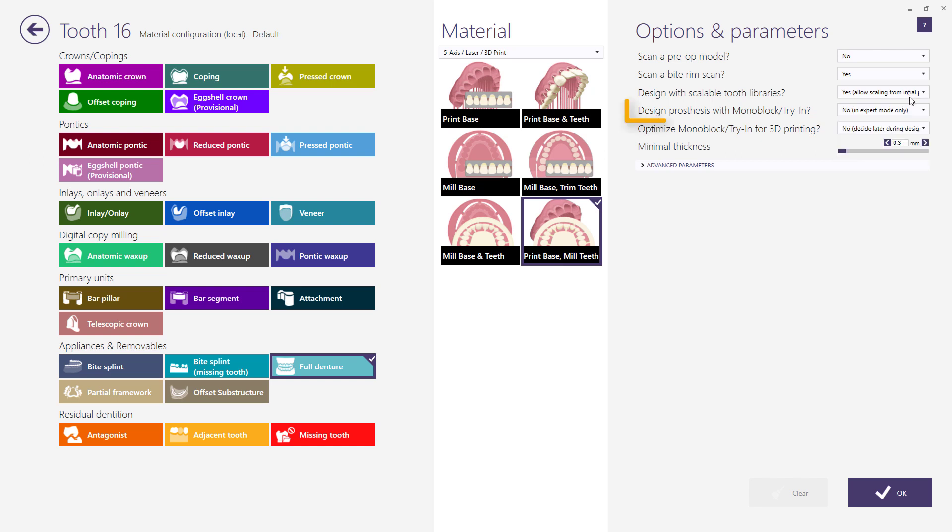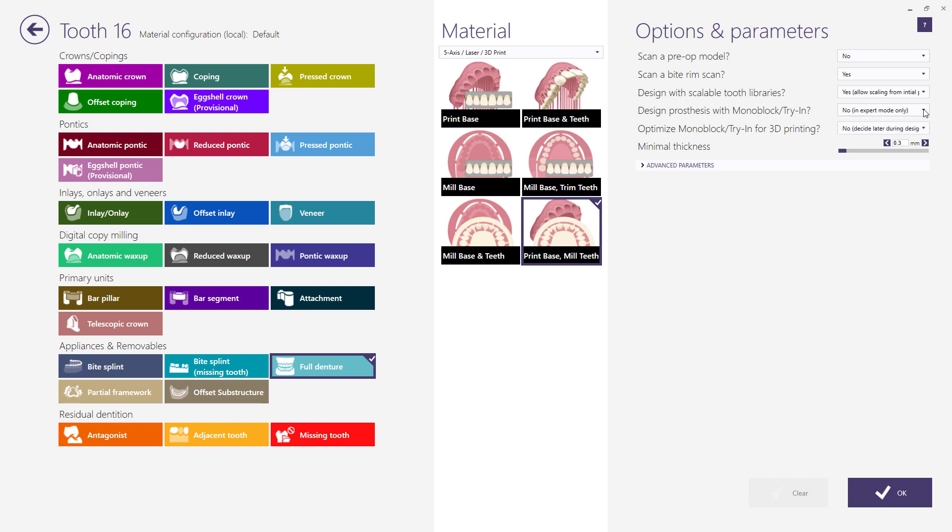Design a prosthesis with monoblock for try-in. Note, monoblock can only be created for open and semi-closed libraries.